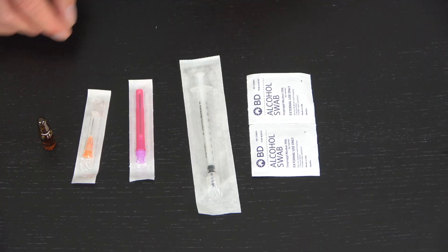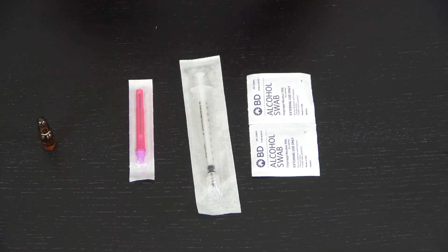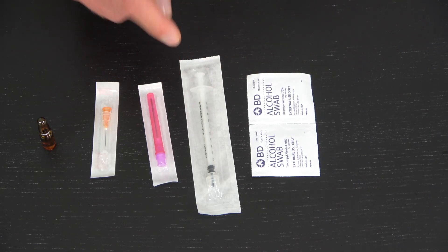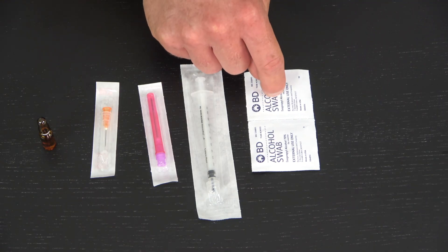You'll need your testosterone — we've got ampoule testosterone here. We've got our injecting needle; because I'm doing a deltoid injection I'm using a 25 gauge, 5/8 of an inch needle. I've got a filter needle, which is a thicker needle for drawing up, and alcohol swabs. I have already wiped this ampoule.